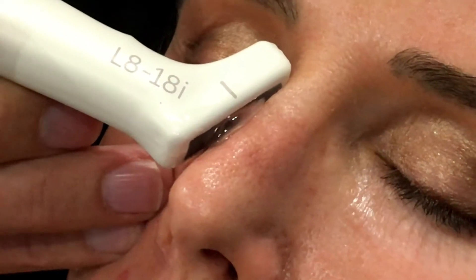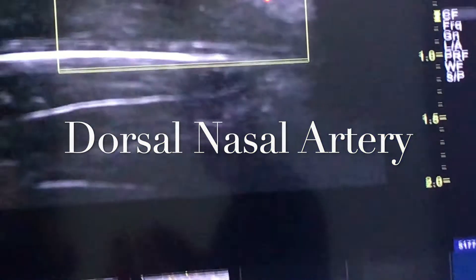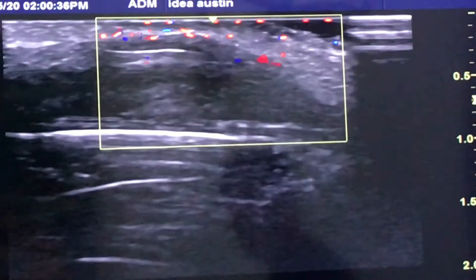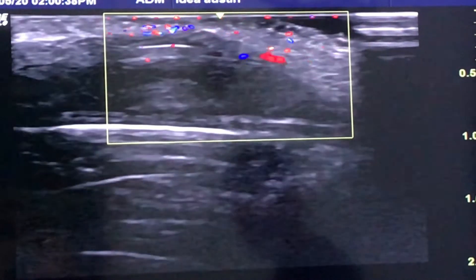What I'm looking at here is a dorsal nasal artery. It's a pretty substantial artery, so you've got to be careful when doing injections in the nose.